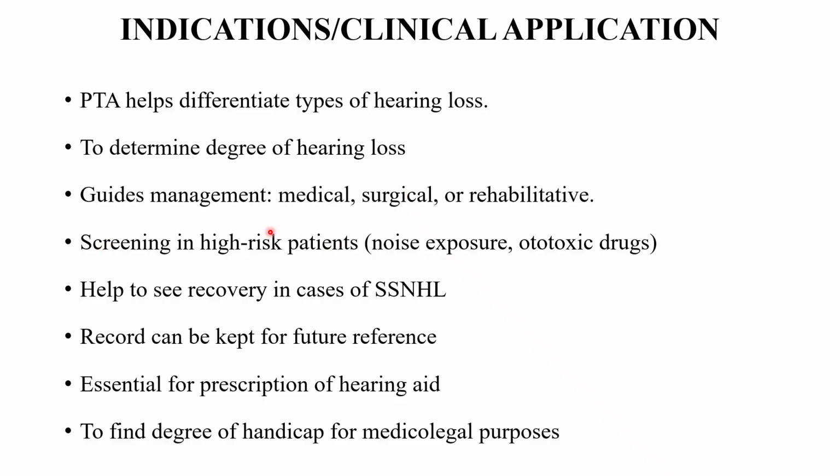Again, screening in high risk patients like those with noise exposure or ototoxic drugs, it has to be routinely carried out in those patients who are dealing with high noise jobs or equipment, like those at airports, in railway stations, in factories.